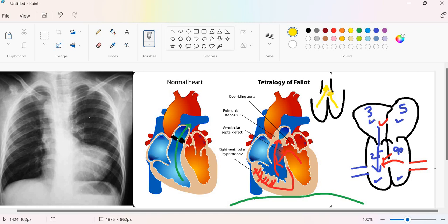So what is the problem in that case? In that case, usually the blood tends to go the easiest way. What do I mean by the easiest way? If the aortic valve is normal and its width is appropriate, and on the other side the pulmonary valve is stenotic, which pathway would be preferable for the blood? The blood will tend to pass through the easiest way, through the aorta, instead of passing through the pulmonary.